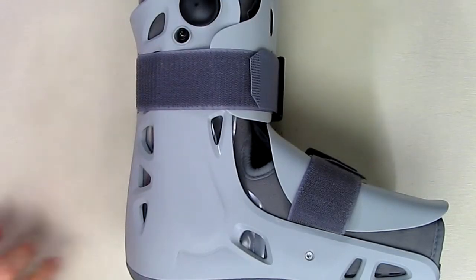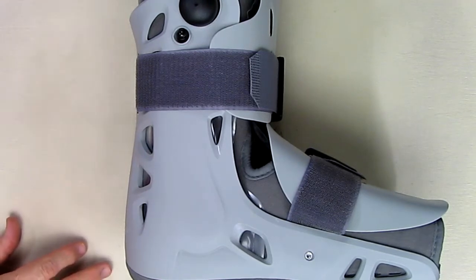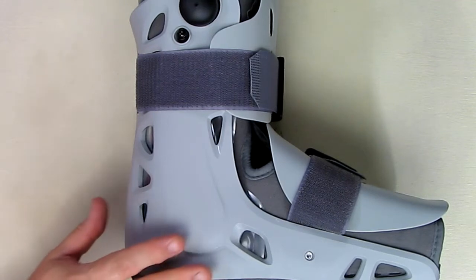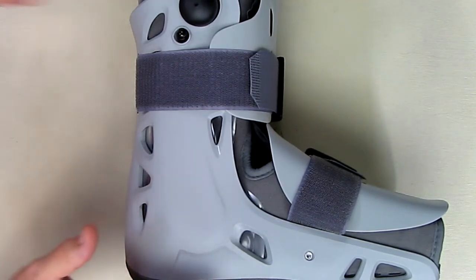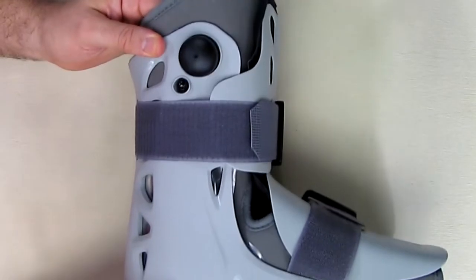Hello again, this is Robert Veach here and this is my video review of the Aircast Air Select Walker Brace or Walking Boot. This is the large size, this is the Elite version, the short. The short refers to the overall height of it. There is also the long version which is longer.